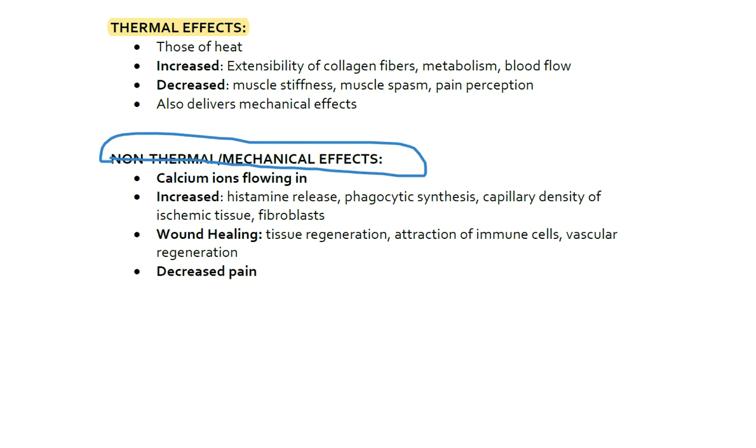Now with this, you'll notice that there's a change in calcium ions flowing in. So there's an alteration in the normal metabolism and the normal process by which cellular nutrients are perceived when this ultrasound wave, this sound wave, starts to disrupt the system, and often in a good way when I say disrupt. What is it going to increase?